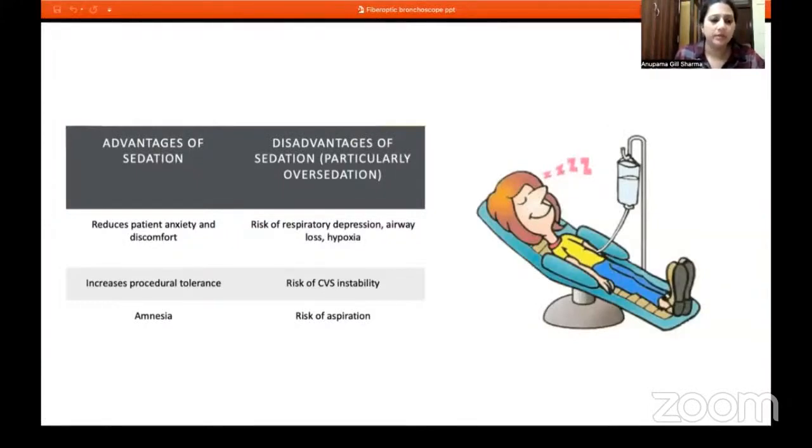So our idea when you are giving sedation is that awake intubation can be achieved with or without sedation, both. But if sedation is used, the aim is for minimal sedation, so it does not affect the patient's breathing or cause hemodynamic compromise. He maintains the ability to speak or respond to your verbal instructions. And yet he should be deep enough to be relaxed.